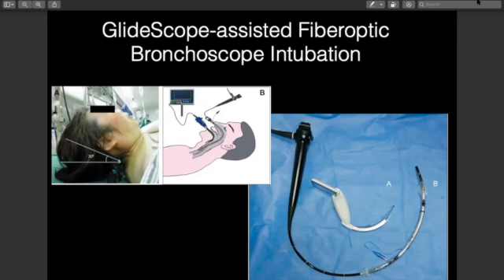Now remember, extubation has the same problems that intubation had as far as ventilation. So don't extubate unless you're confident that the patient's going to be able to maintain. And there are all techniques where you leave a catheter in the trachea as you remove the endotracheal tube in case you had to emergency reintubate, or maybe you'll extubate with a surgeon who's ready to do cricothyrotomy if there's failure. Always have plans for extubation.